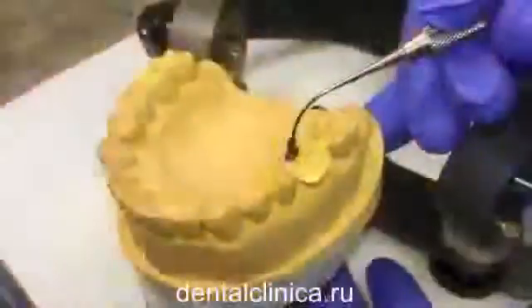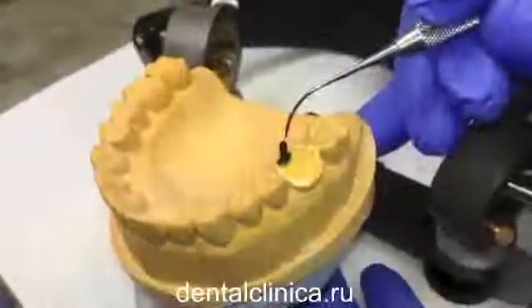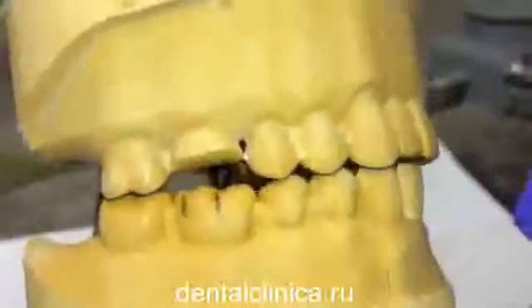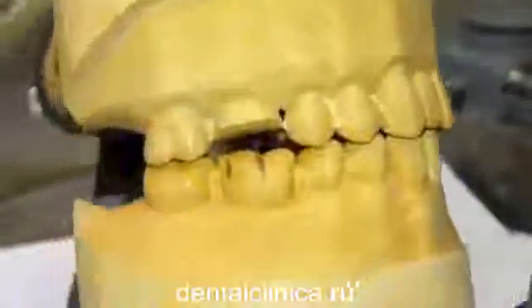First, we create cones. We will begin with the mesiolingual cusp of tooth number 3. It is important to check that the cones are meeting in the proper receiving area of the mandibular opposing molar.